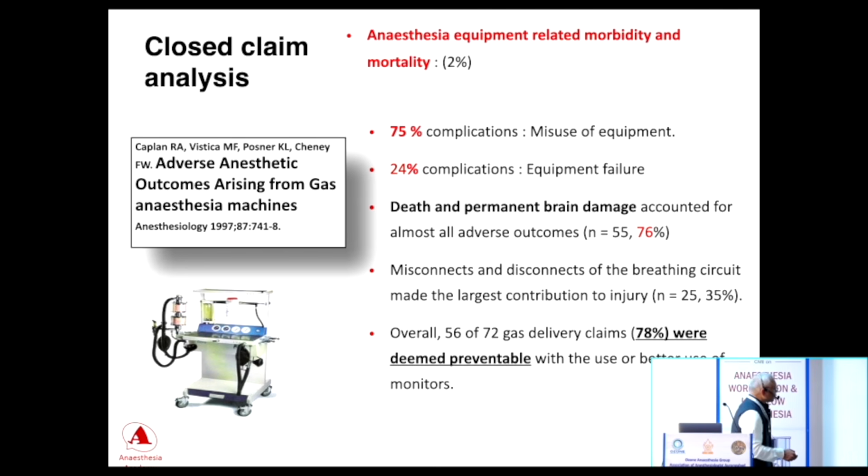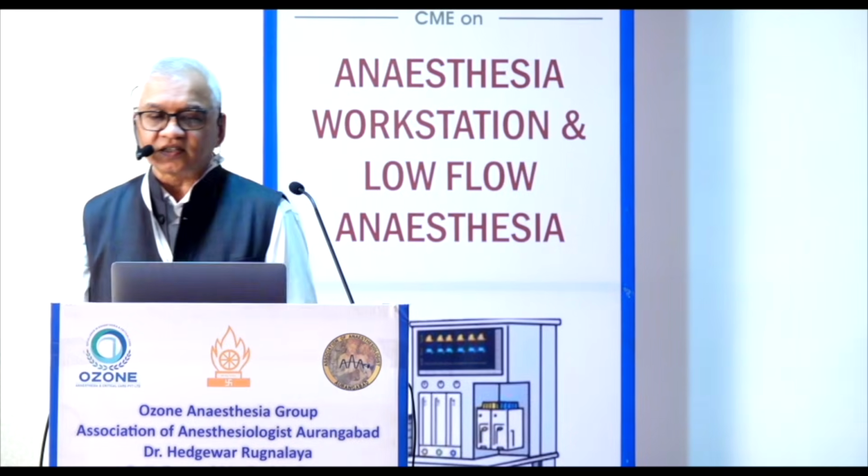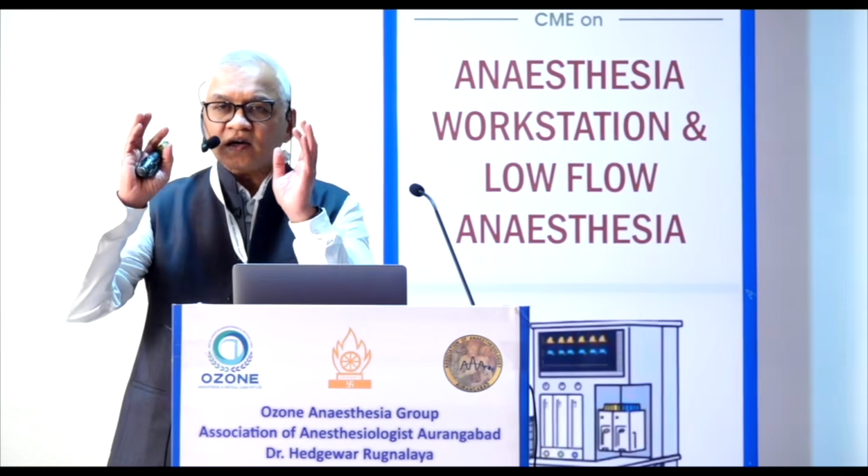Only a small portion was equipment failure, and death and permanent damage because of this was very large, 76%. 78% were deemed preventable.